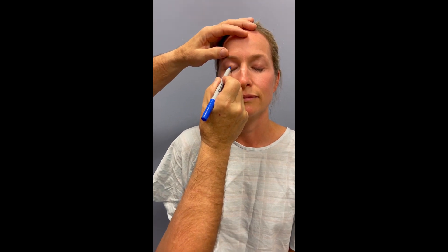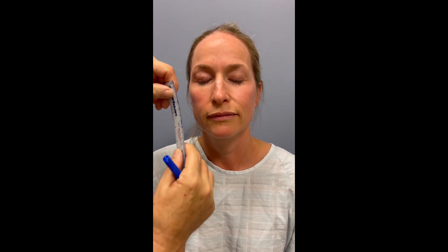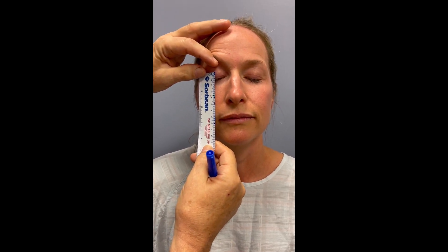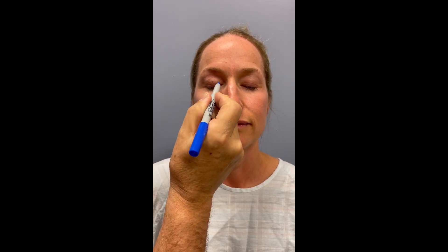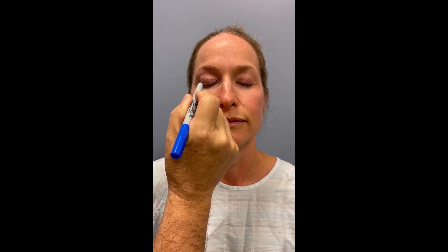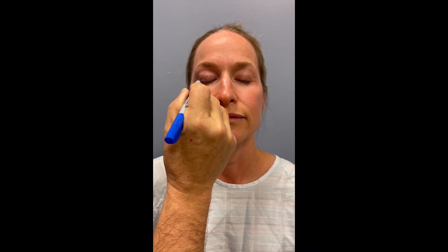The first mark is exactly where the eyelid fold is, and that is between eight and ten millimeters from the eyelashes. As you can see here, it's about ten millimeters — that's perfect. We will follow that natural line all the way across.